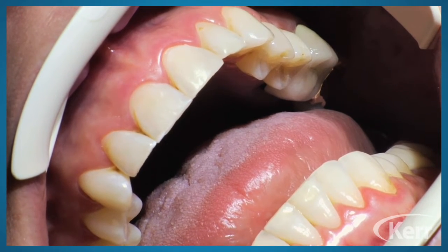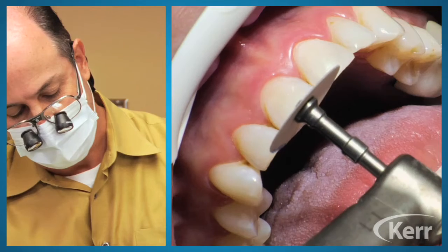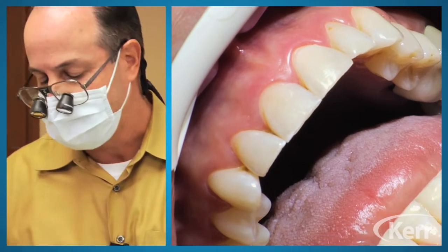So just trying to create an incisal edge plane with that disc. If you notice the angle that I was putting that at, it wasn't at a 90-degree angle, but it was slightly at more of a 30-degree angle to the lingual is really what you're kind of shooting for. That's classically what you want.